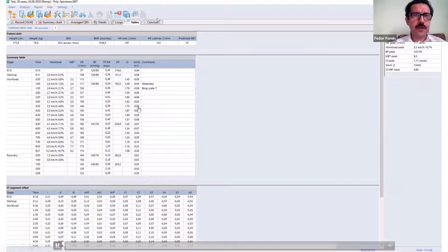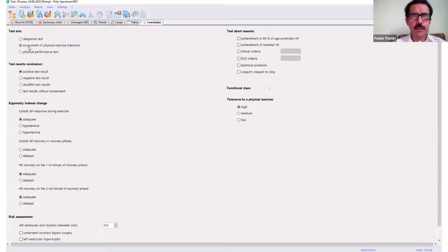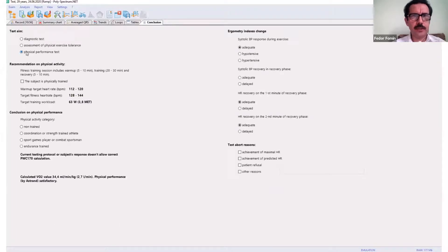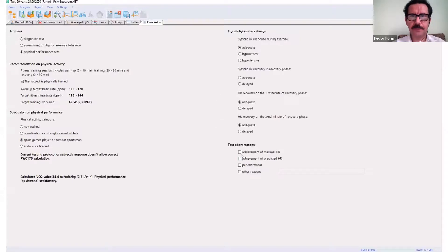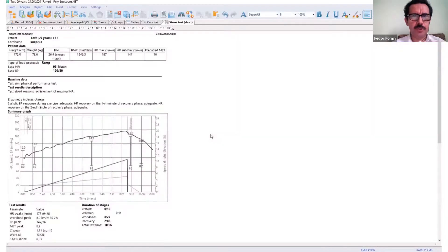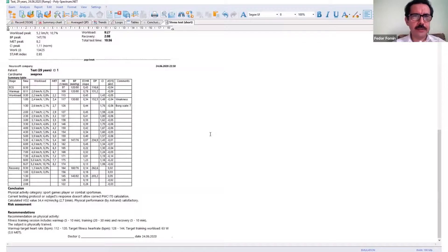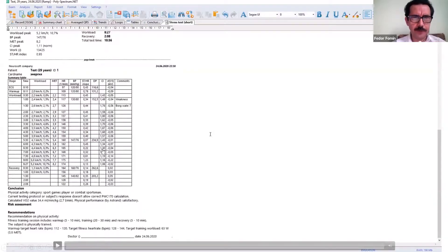I have these tables and a tool to perform a final conclusion. If this person is quite healthy, I select physical performance. Some parameters are calculated automatically; others I enter manually. When finished, I press the report button and get a final report with all features — text, tables. This is quite flexible: I can set up different configurations of the final report.